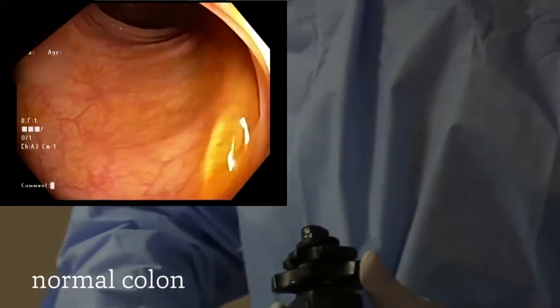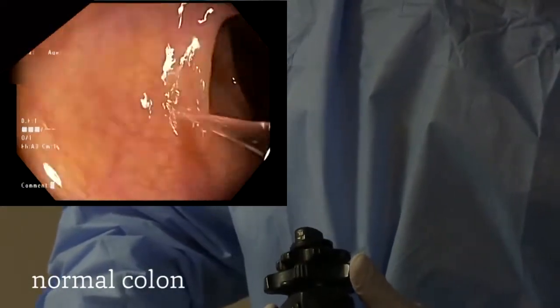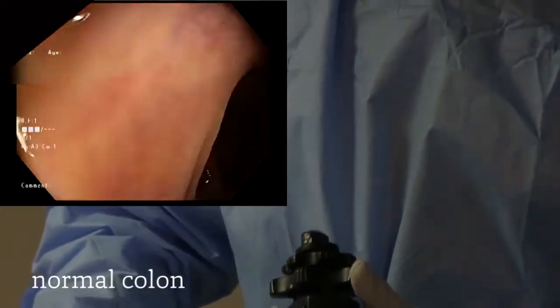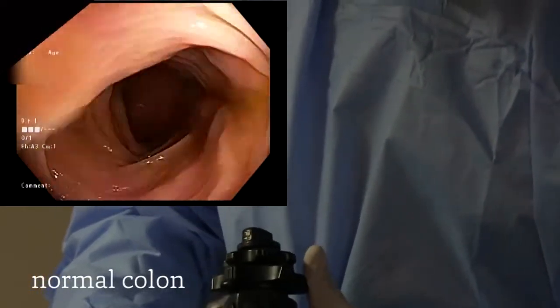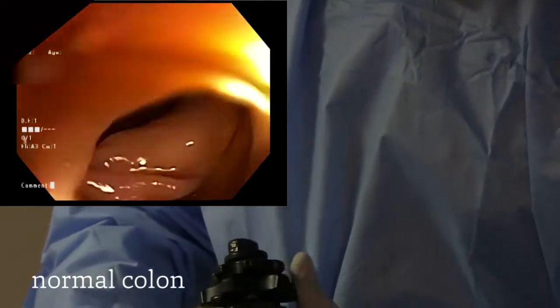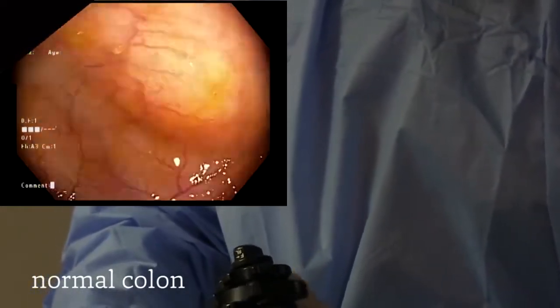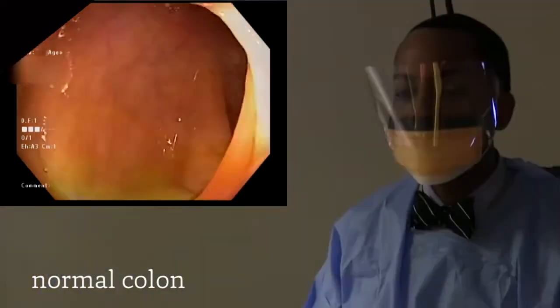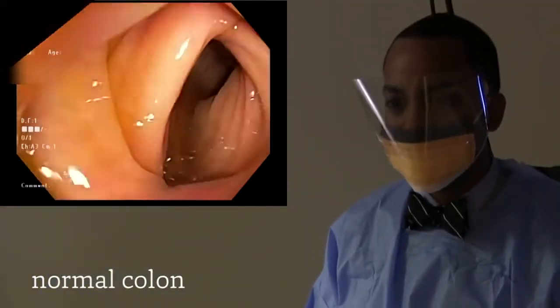We are now about to round another corner, transitioning from the transverse colon into the descending colon. Again, being very careful to remove any liquid and sediment that we find along the way that could potentially hide any polyps.